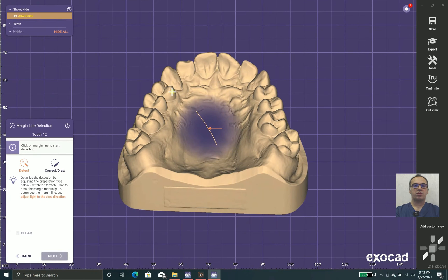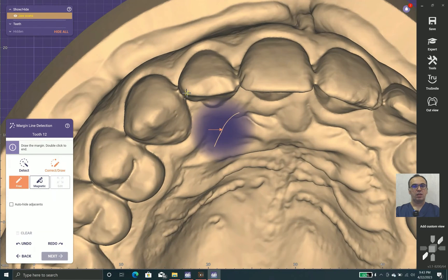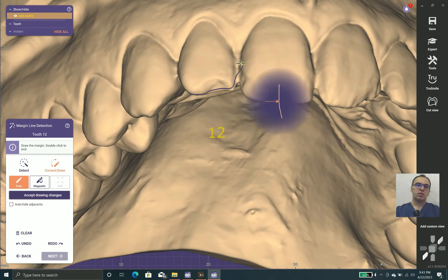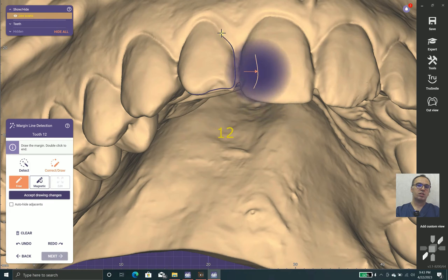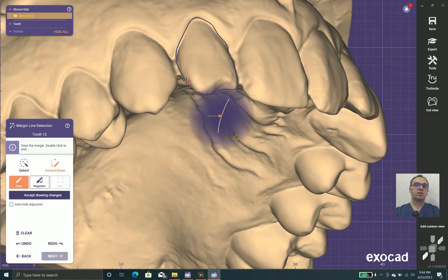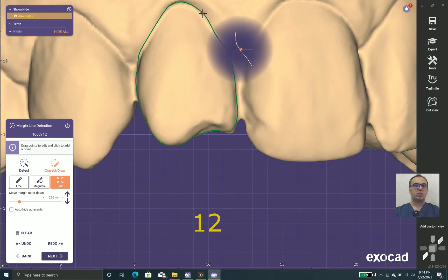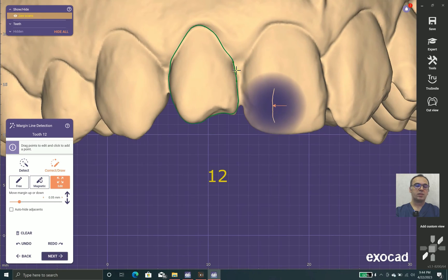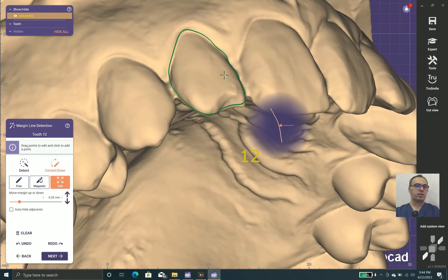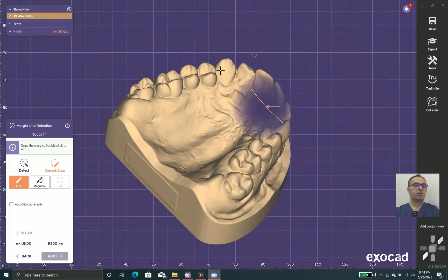After choosing the proper milling machine and material, we draw the margin lines. Drawing margin lines at the incisal and cervical are almost easy, but in mesial and distal we should take care. If two margin lines hit each other, the laminates will collide. If they have too much space, you need to fill the space with composites, which is not stable long-term.